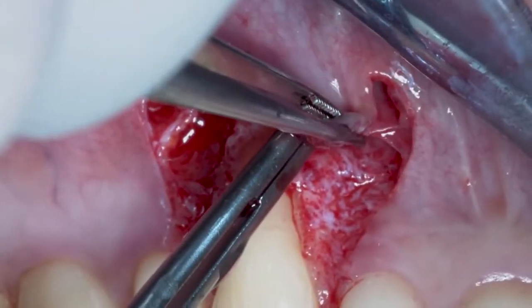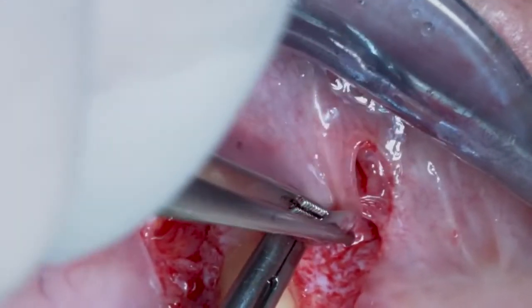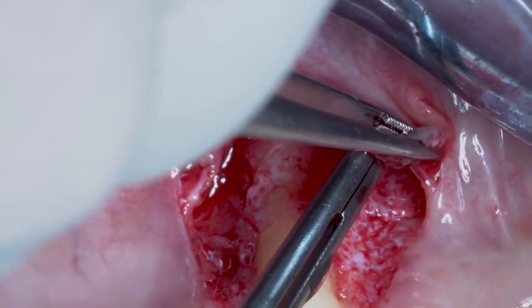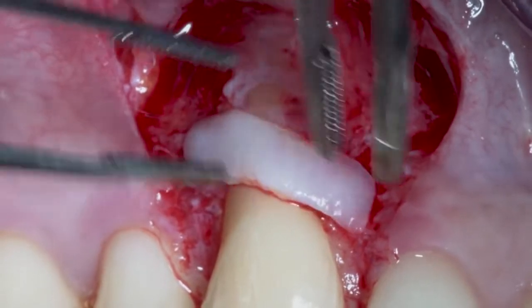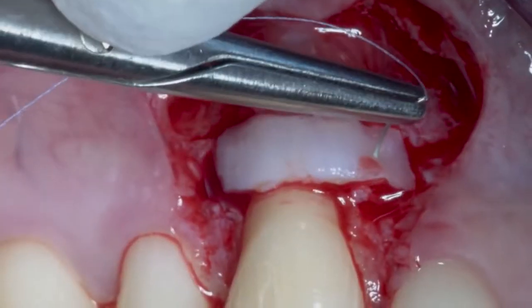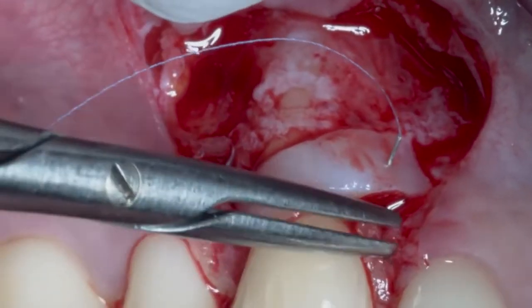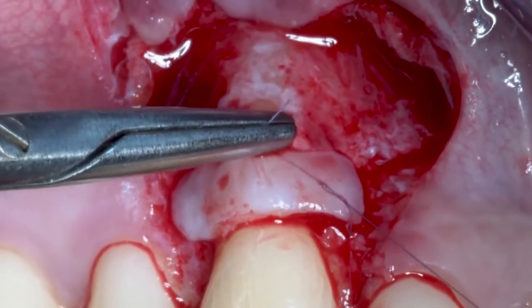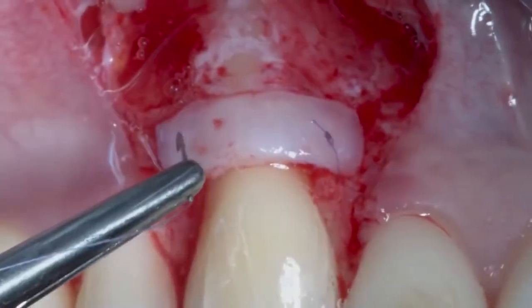When we pull down the superficial mucosa to cover the connective tissue graft, the muscles will stay deep in the fornix. The third concept is that in a case like this you need to improve the quality of your tissue, and you have to do that not with artificial tissues like collagen matrix — because they don't work in cases like this — you need autologous connective tissue.